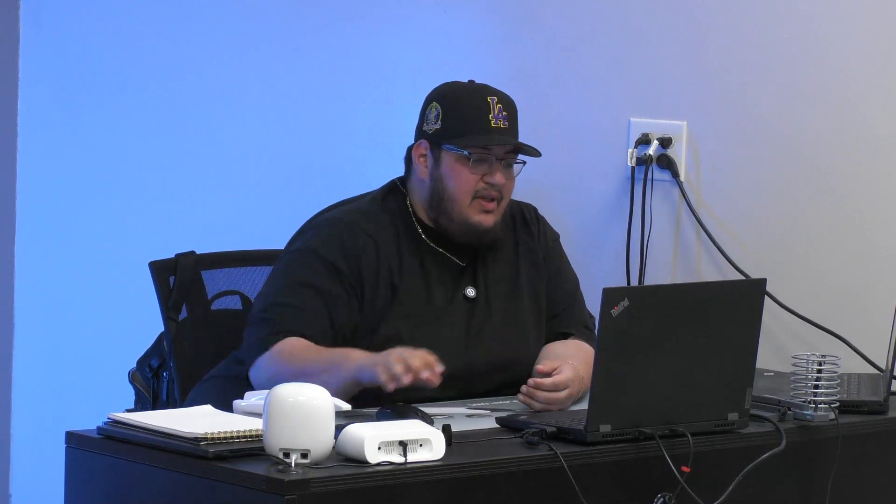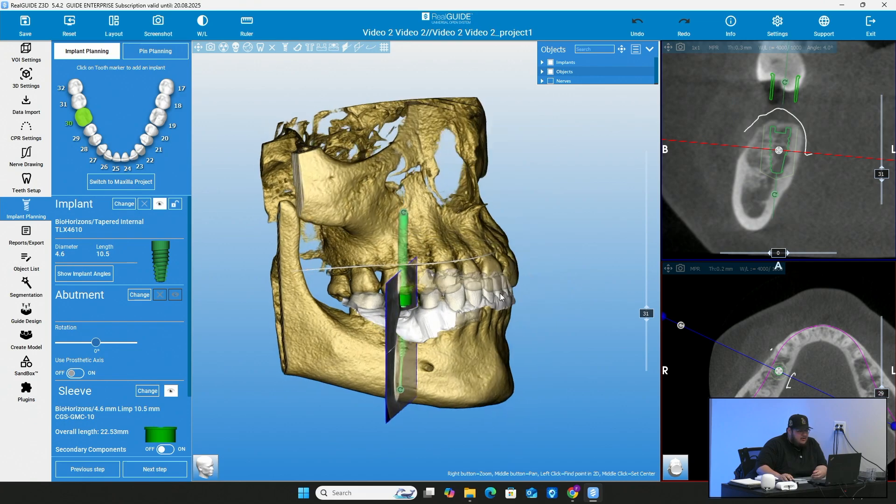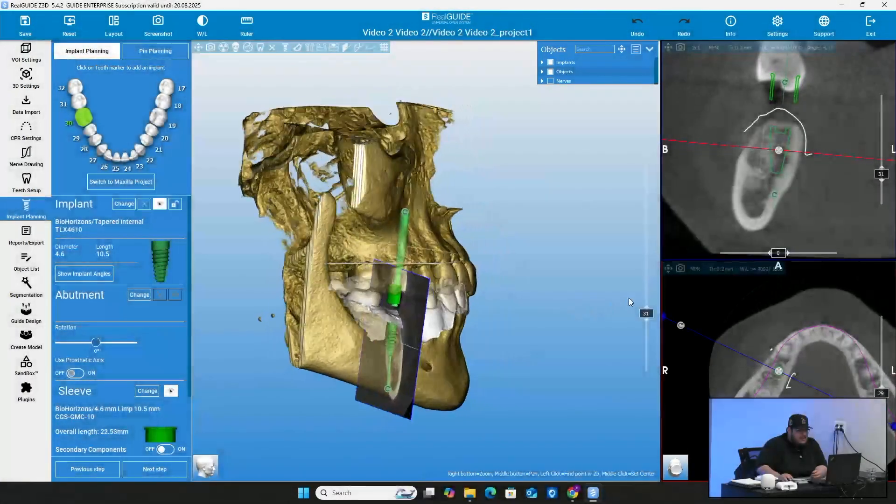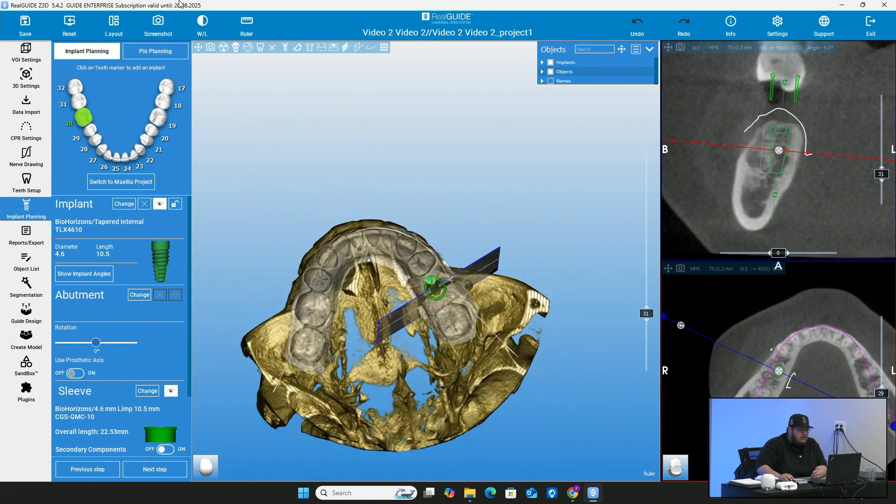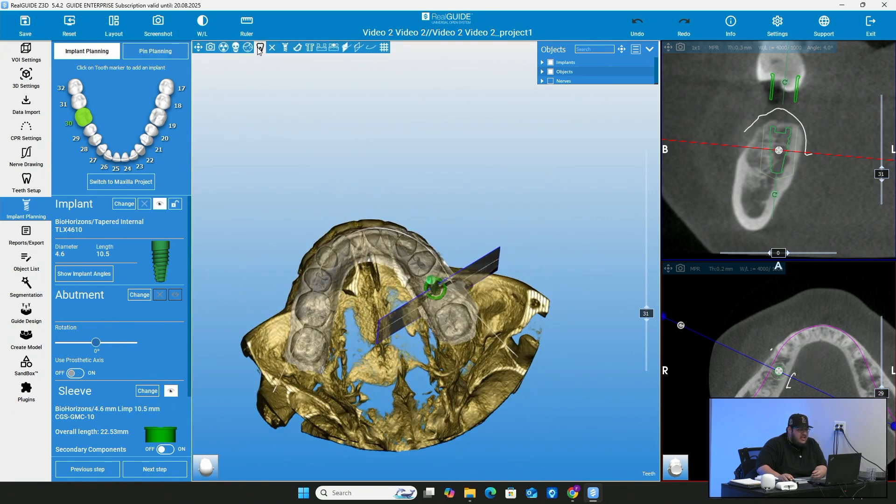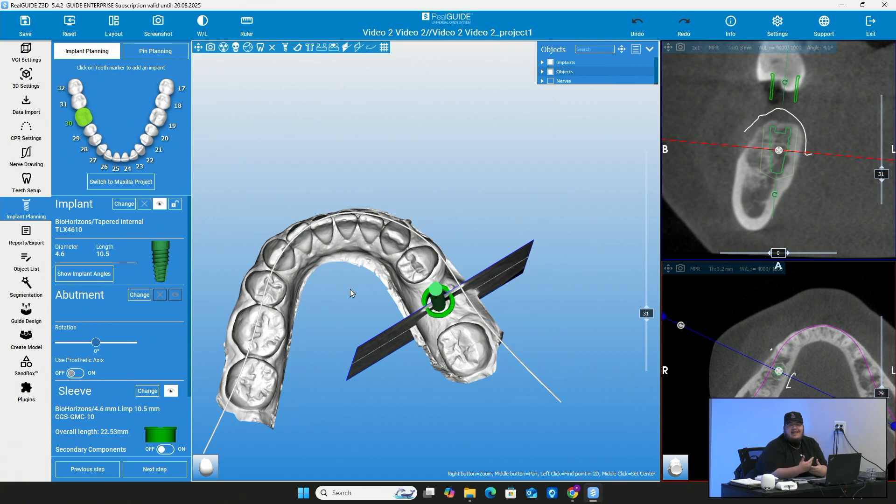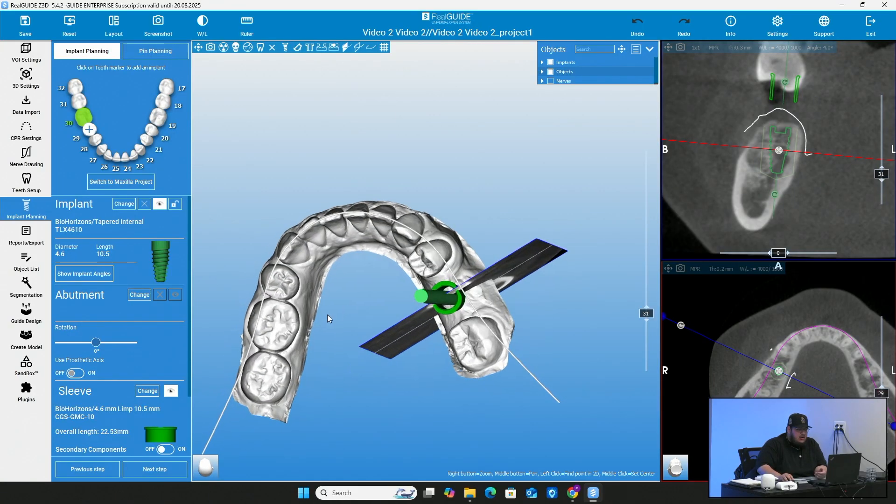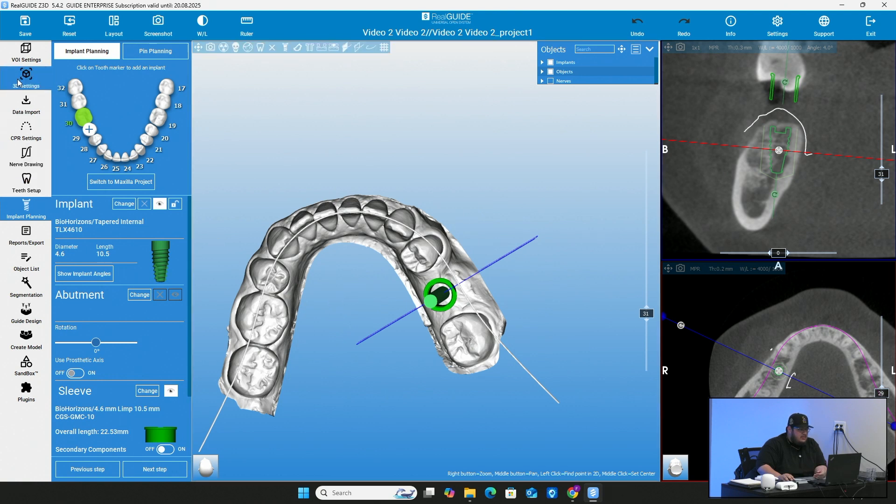Here's my plan. I have it as a BioHorizon, it is a 4.6 by 10.5 millimeter. All we're going to do is pretty much take this intraoral scan that we have and we're going to make it into a model that is retrofitted to be able to put a digital implant analog. So what we're going to do is go straight to the left side with all our tools and we're going to go to the bottom where it says create model.